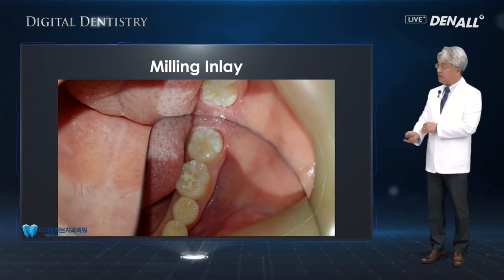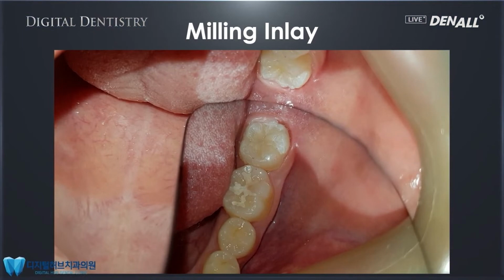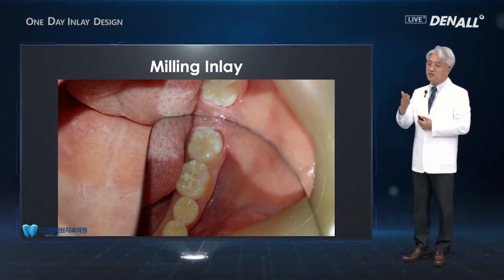So this is the clinical case. As you can see, on number 7 or 6, the fit is really good, it looks well fit. If you just remove the resin cement, then I think we can gain very good margins.